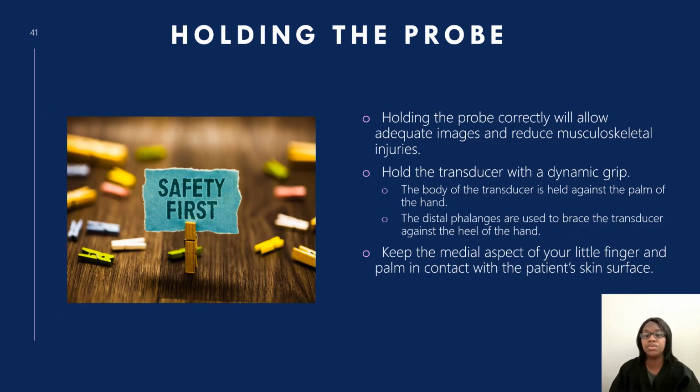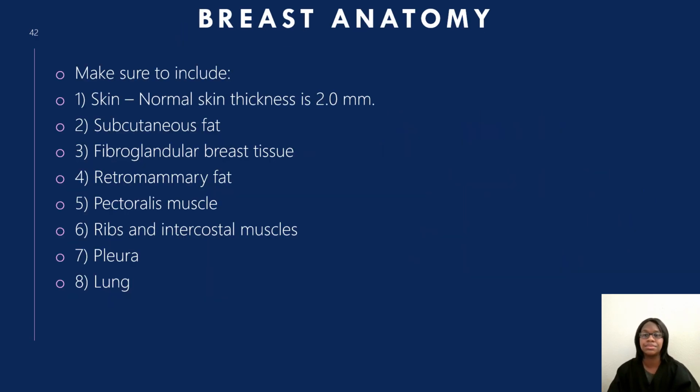Now, we do hold the probe to do the scan, and it's a certain way you have to hold it so that you do not injure your hand or your wrist. Scan with your wrist, turn your wrist. And this is just like a background of ultrasound, just so you know kind of like the history of it, because in a moment I'm going to cover the lesions.